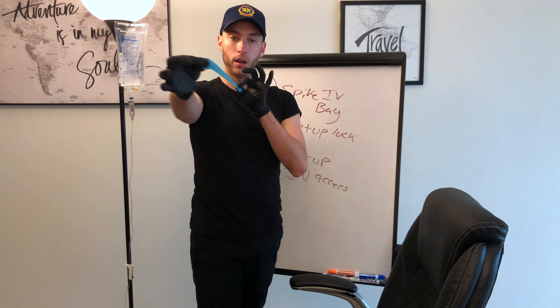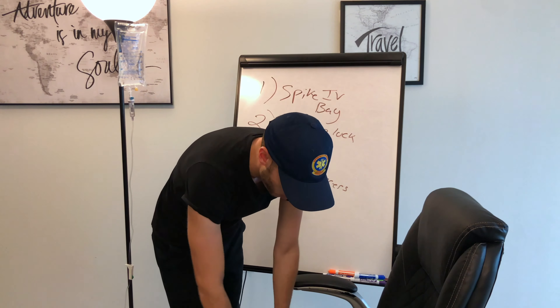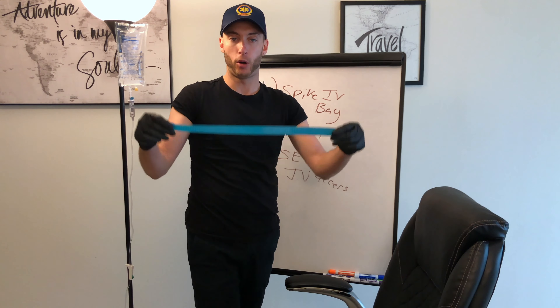Alright, it's going to be a quick pinch. Quick IV, give you some fluids. The first thing we're going to do is take our tourniquet. I'm going to grab this one — it's a little longer. So here's our tourniquet. I'm going to pretend this chair is the patient's arm, and we're actually going to do the IV right on the chair here — make a little puncture.